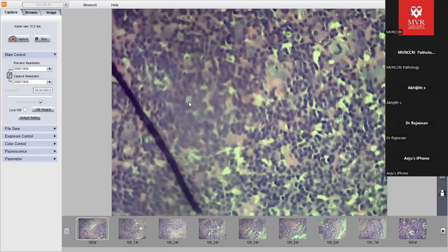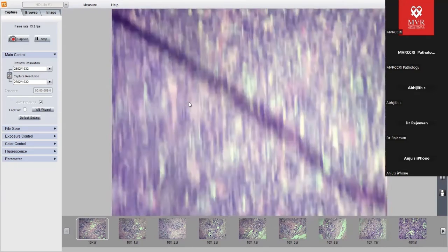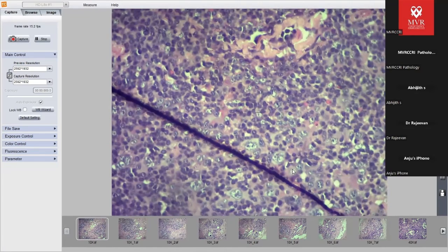I wanted to show you some popcorn-like cells, as I described. Maybe this is some sort of popcorn, if you can stretch your imagination. Anyway, there are large mononuclear cells, binucleate cells, with prominent nucleoli in a reactive background.